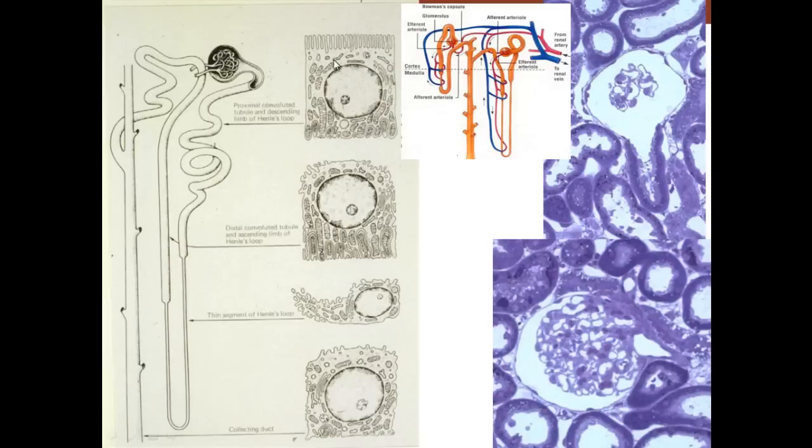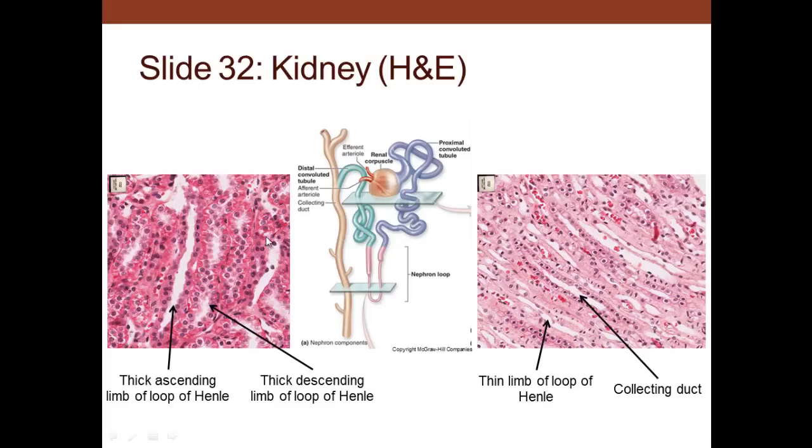And here we can see the proximal tubule has a brush border, as I mentioned, infolded with lots of mitochondria in through there. Distal tubules have a lot of infolded microvilli, as opposed to a brush border that you have in a proximal tubule. Thin loop of Henle, and then the collecting tubules seem kind of washed out because they're more passive, as opposed to these guys that are really active and pumping. Proximal tubule, distal tubule, collecting tubule, and you have the peritubular capillaries and the vasa recta that go in through here. We can see that again.